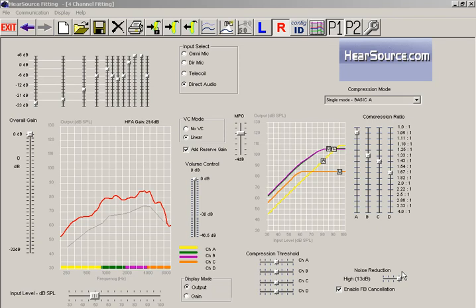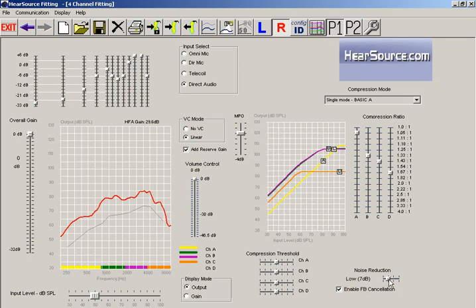The hearing aid can detect this and automatically reduce this by this number here. So we're seeing a 13 decibel reduction by setting this on high. But I can manipulate this slider, so I can set it on medium or low, or I can even turn the noise reduction off.